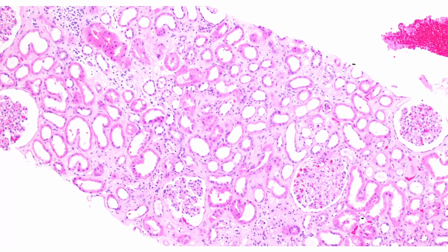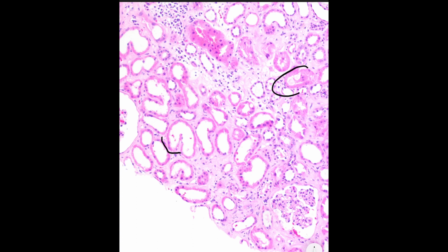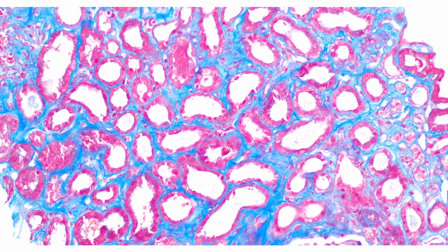So, what do we see on light microscopy? So on low power, we have cortex that shows tubular epithelial injury. We can see here that there's attenuation, there's thinning. We also have some vacuolization, and there's cytoplasmic swelling and also reactive appearing nuclei. When we look at the trichrome stain, we can see that there's worse interstitial fibrosis compared to the tubular atrophy, also known as a protracted pattern.